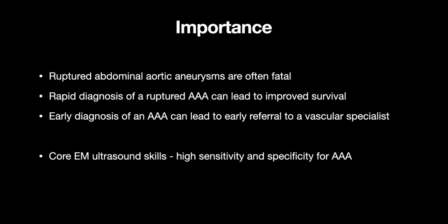So from a clinician point of view, it's important because assessment of the aorta using ultrasound is one of the core emergency medicine point of care ultrasound skills that are required for ED, EM clinicians. And it's got a high sensitivity and specificity for the presence or absence of aneurysms. So it's a very good skill to learn if you're an A&E clinician.